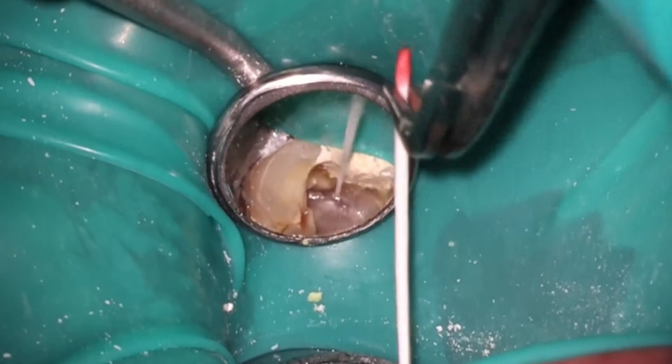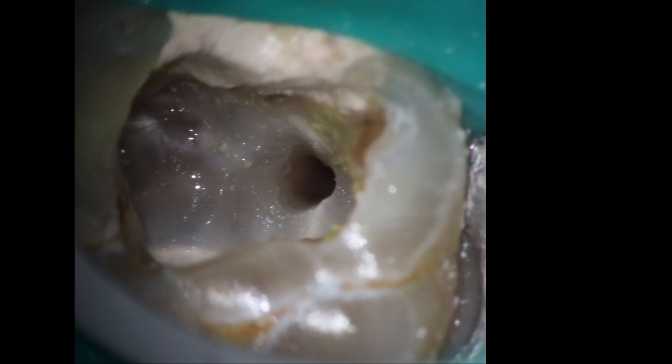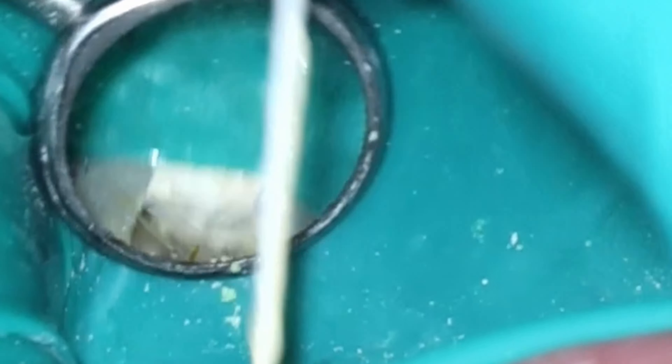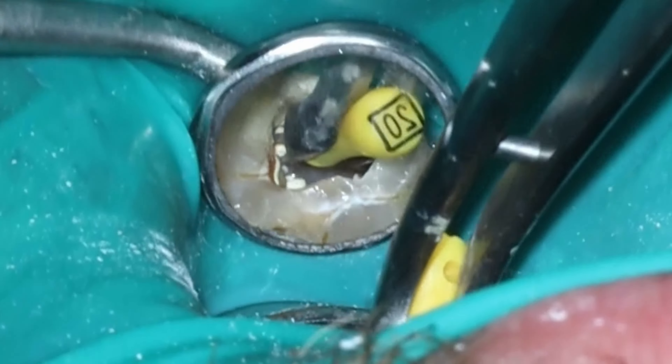This is one that I don't generally restore for. That said, I do still think as a specialist, our job is to make other people's lives easy. So one of the things — you can see the decay there on the buccal — I will be taking that out. There's still some hidden underneath there, and there's the groove from the DL, so all of that will come out. I like to wait because we have such a nice dry field. I'm going to finish the squirt technique, get it all taken care of, go back down, and recapitulate with a 20K file. This tooth from the operation standpoint is very predictable — it really wasn't that infected, so I'm not worried about pushing anything out the end. I do have to do a little bit of handwork just where the two MBs come together, and that's common as well.